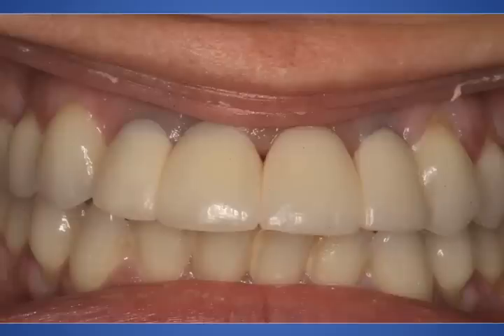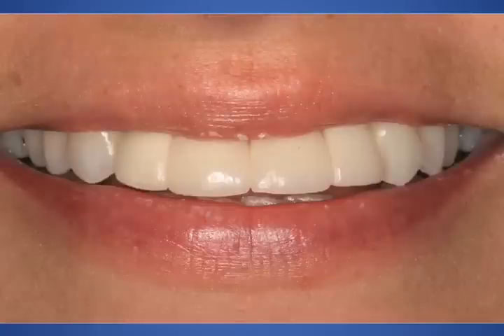Still not ideal. You can see the little purplish of the gingiva in the lateral incisor areas, but that area has been traumatized quite a bit over a number of years, and then traumatized again when we extracted the teeth and placed the implants. So I'm not overly concerned with that. We're just trying to create some interdental papilla for this woman. And again, a smile line immediately on cementation or placement of the temporary crowns.